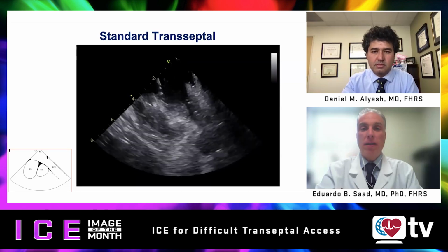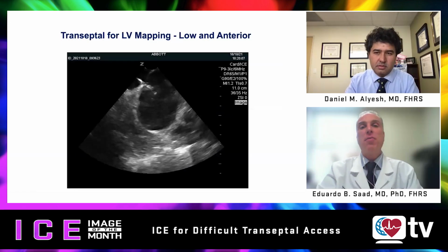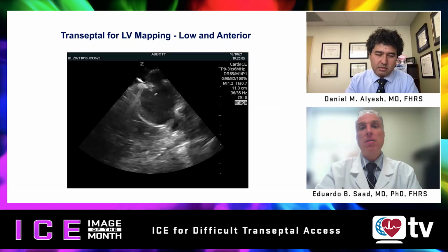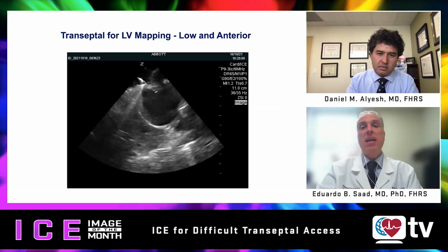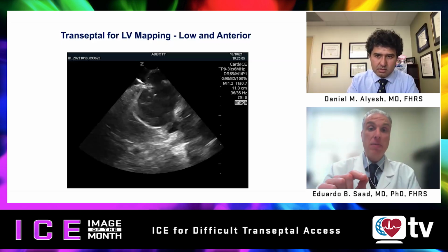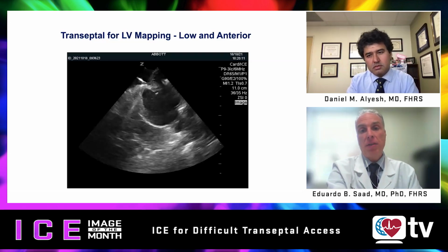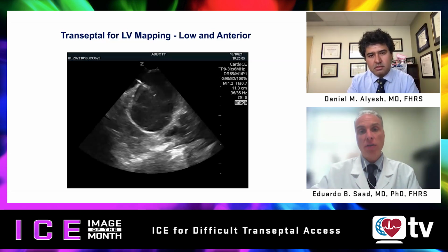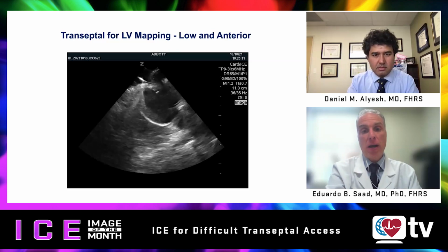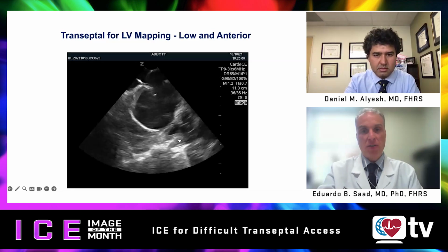Maybe in the next example, you're going to show that if you're using the transseptal for VT ablation, or even nowadays for PFA ablation, you want to free yourself more space. We like to go across more anteriorly on the septum and maybe more inferiorly as well. In this view, we see the dilator already across to the left atrium. We are also seeing on the same clip the mitral annulus at 6 o'clock and the left atrial appendage at about the 5 o'clock position.